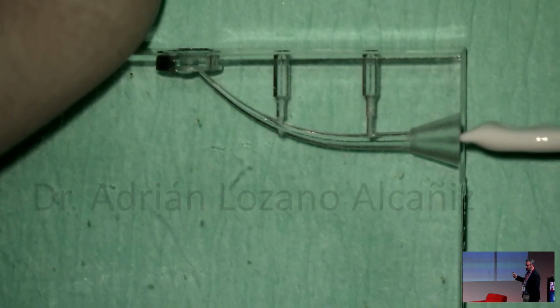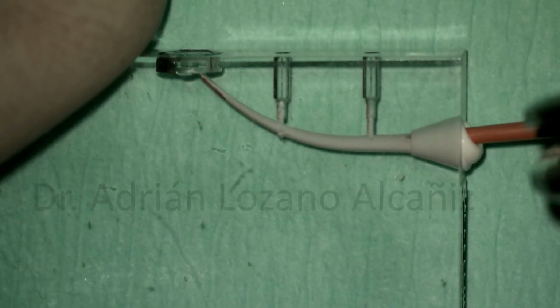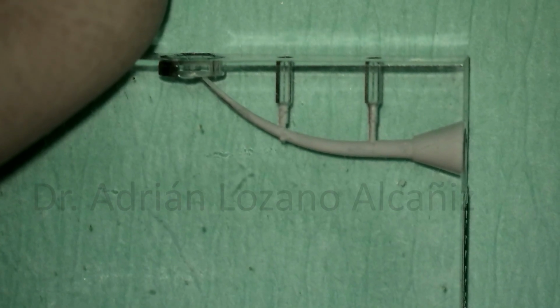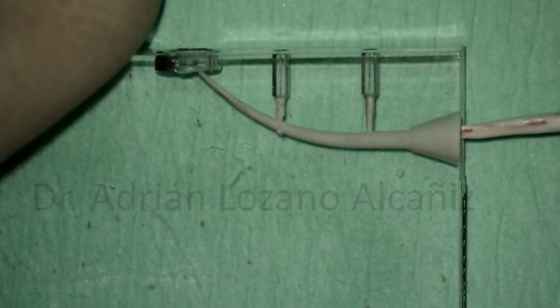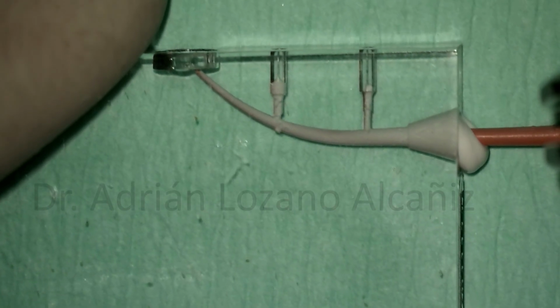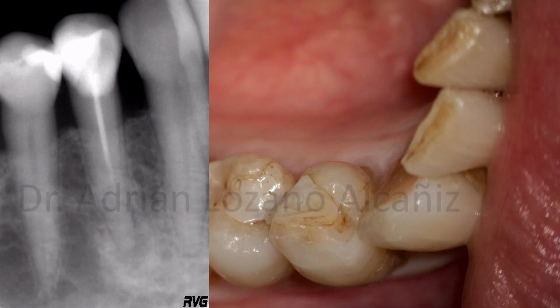This is the pumping motion. You can see here how the sealer is going to the apical part and the lateral canals, and then cutting 1 millimeter, moistening the gutta-percha point and going through the canal until the working length. Let me show this case.